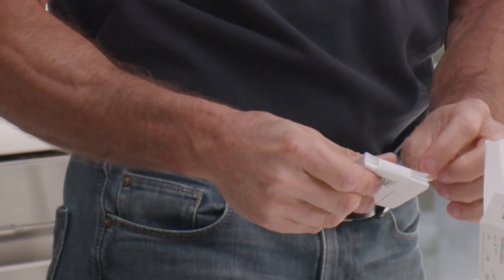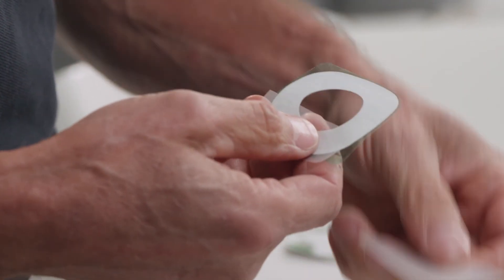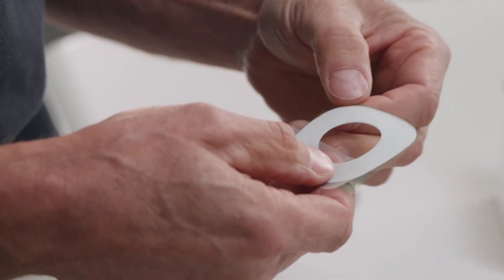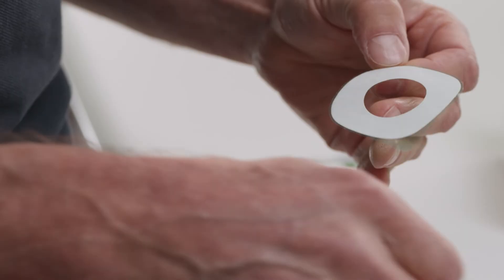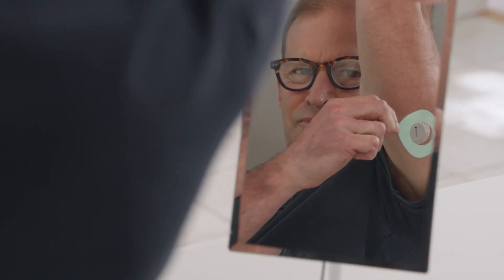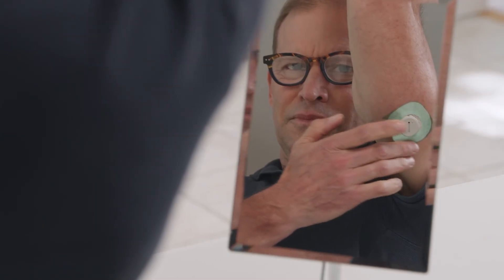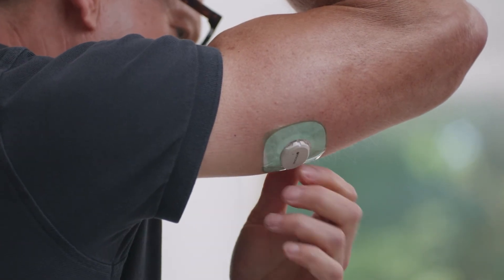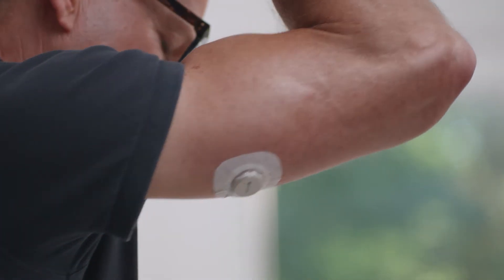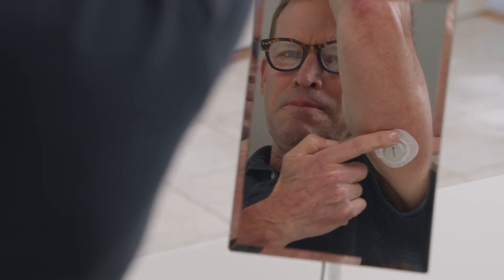Your overpatch will help you keep the sensor on and is bundled with your instructions in the box. Carefully pull off the clear liners one at a time. Please don't touch the white adhesive area. Use the colored tab to place the overpatch around the sensor — you may need to look in a mirror for this part. Rub around the overpatch, then use the tab to peel off the colored liner. Then rub around the overpatch again.